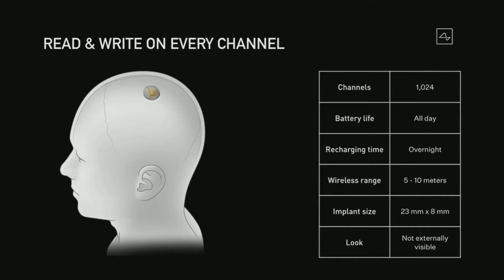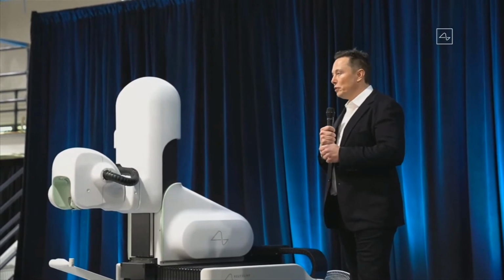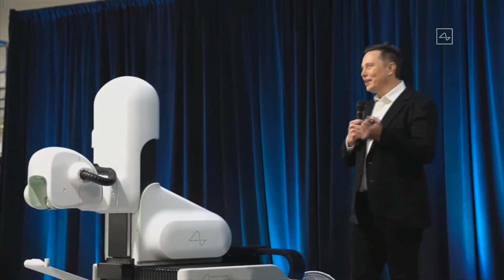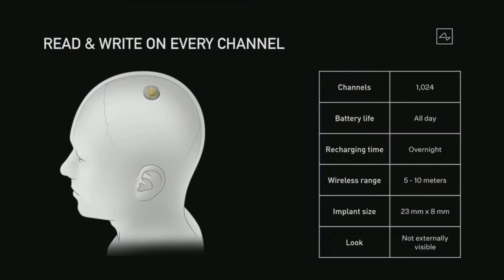This would connect to your phone, and actually the application would be on your phone, and it would be communicating by essentially Bluetooth Low Energy to the device in your head. That's why I say in a lot of ways it is like a Fitbit in your skull with tiny wires. And then, like I said, you would not be able to see the device at all. You would look completely normal and just have a small scar under your hair.